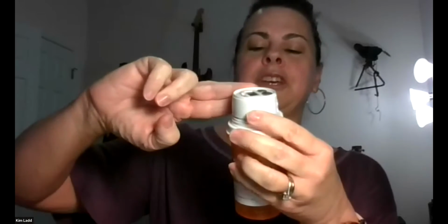It's called the Talking Pill Reminder. Basically what it is, is a white circular device, a little bit bigger than a dollar coin. It's about as thick as 1.5 finger widths. It has 2 buttons on it, and it has a display with a clock.